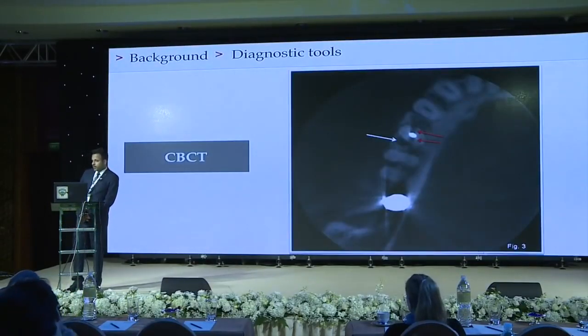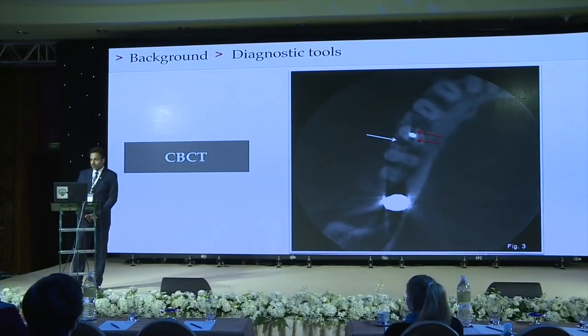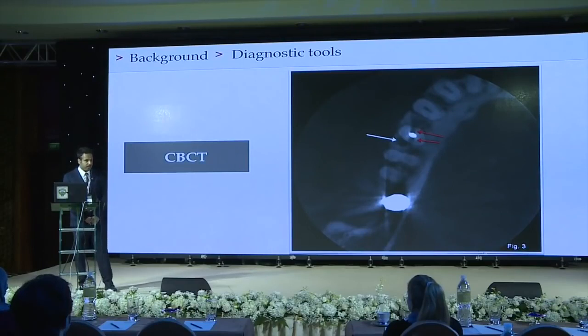CBCT has proved itself to be a very helpful diagnostic tool. It can look at the lesion in three dimensions and look at the anatomy as well. And it is really a good tool. But we still have problems with beam hardening.